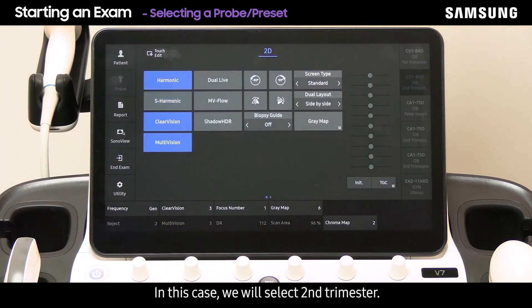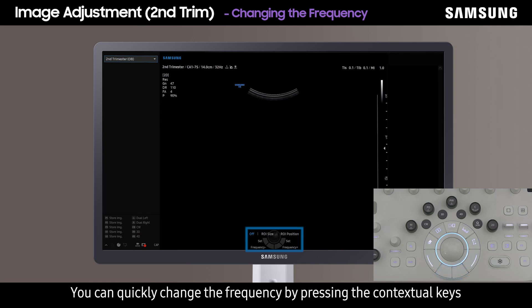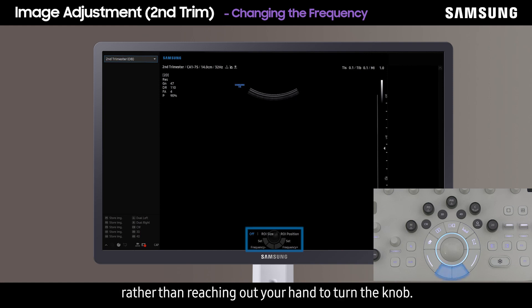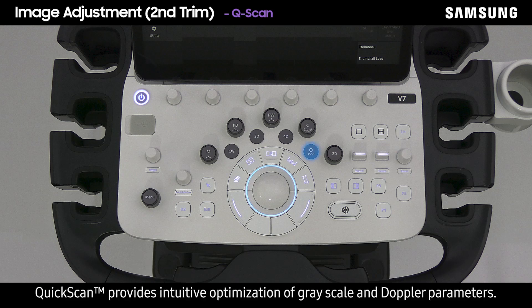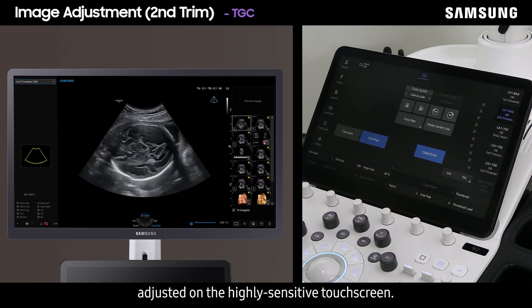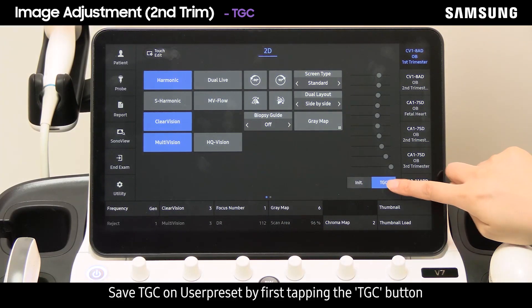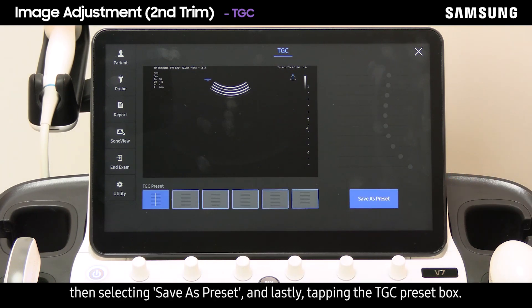In this case we will select second trimester. Now we're in scan mode — the key configuration can be seen on the bottom of the screen. You can quickly change the frequency by pressing the contextual keys. Quick Scan provides intuitive optimization of grayscale and Doppler parameters with just a swipe of the finger. The TGC can be quickly and accurately adjusted on the highly sensitive touch screen, and saved to a user preset by tapping the TGC button, selecting save as preset, and tapping the TGC preset box.